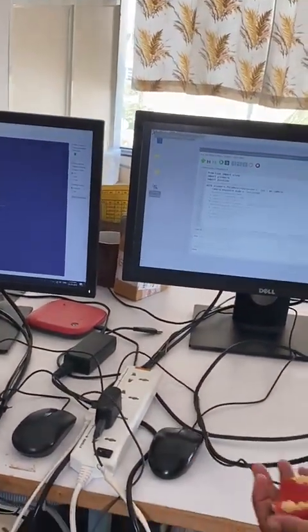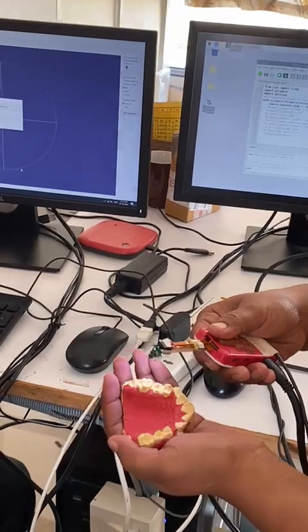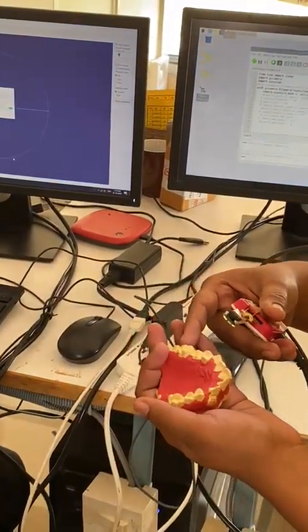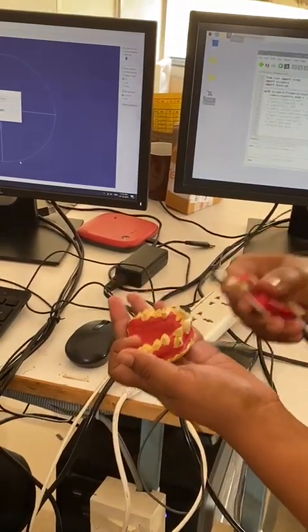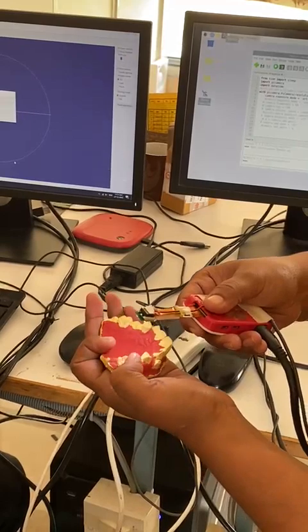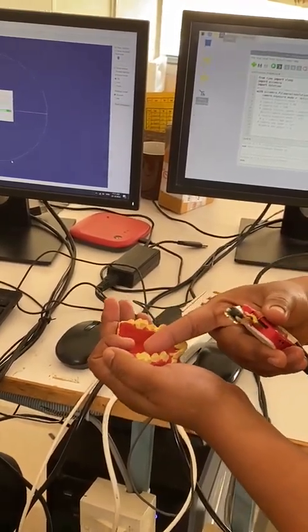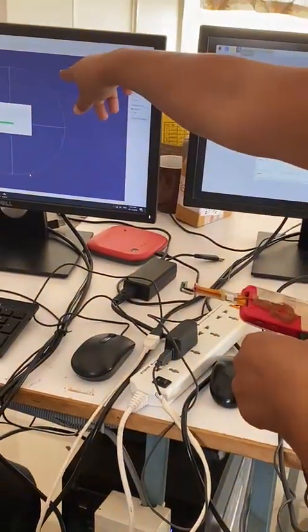Any person for that matter, when we scan, we will take the pictures with Trios as well. So we will not be able to get the entire complete thing. So what we do is we do a second time scanning as well. In the first time scanning, I'm trying to create the depth of the surface, and also I'm trying to calibrate the ratio at which it is creating the depth. For that, I made a setting over there.